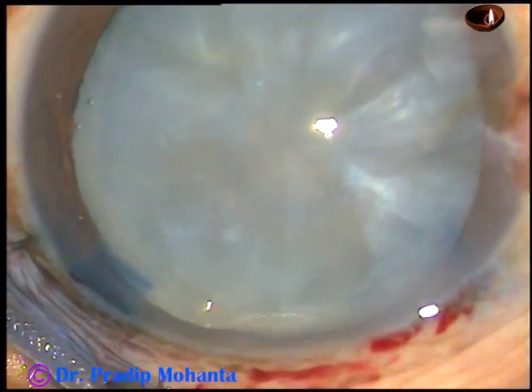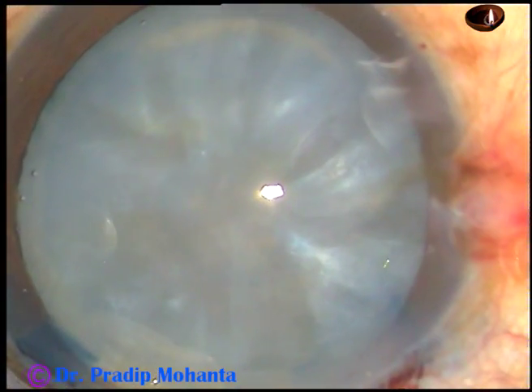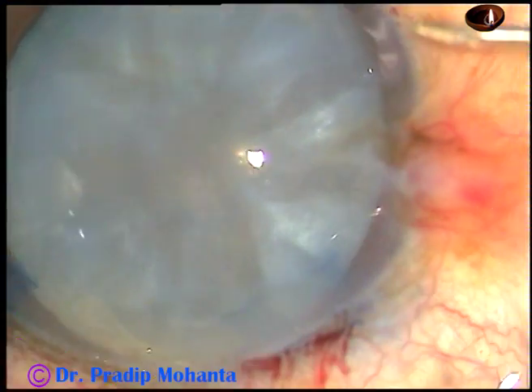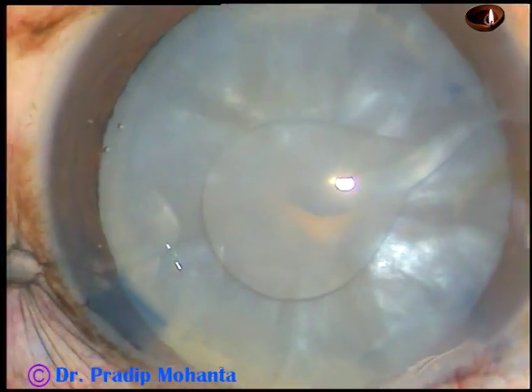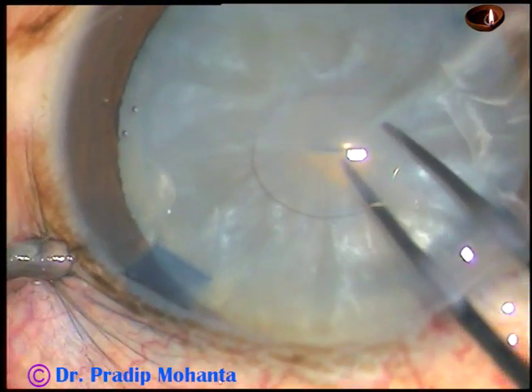In intumescent cataracts, it is necessary to make two side ports. Make sure that you introduce your needle through the right side port and make this C-flap. And you see, a lot of oily fluid has come out.